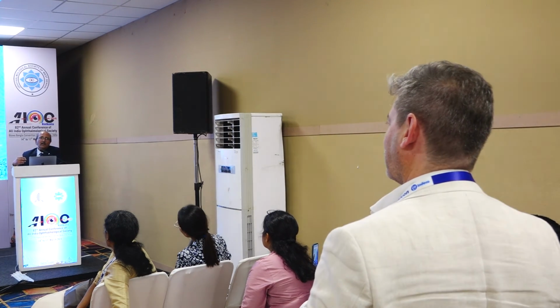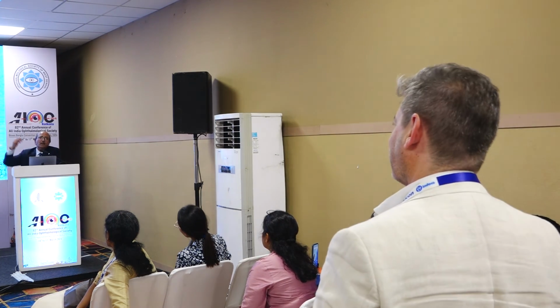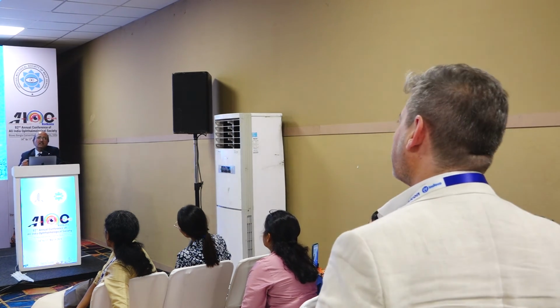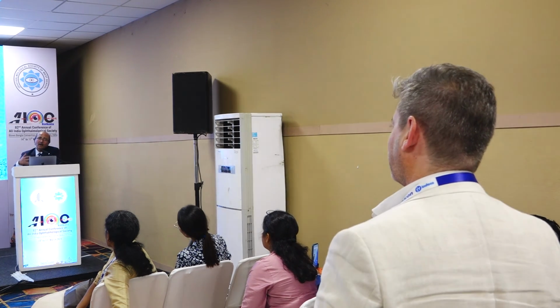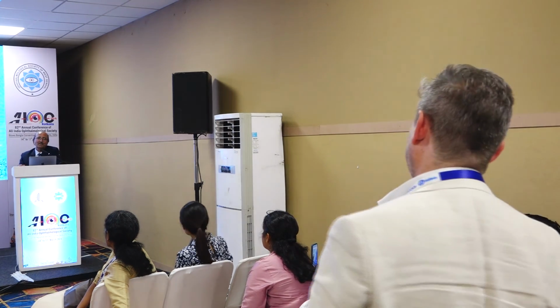Of the children operated by me 35 years back, very few of them have very high myopia, not all, but very selectively. So there an IOL exchange is required. You have to see whether IOL exchange or a piggyback IOL in the sulcus is required. So we have to assess all that. It depends on the case. Thank you very much.